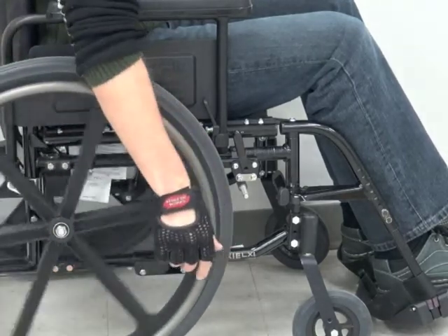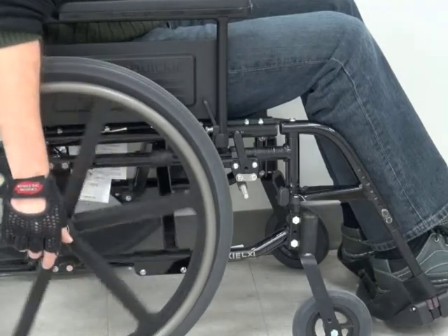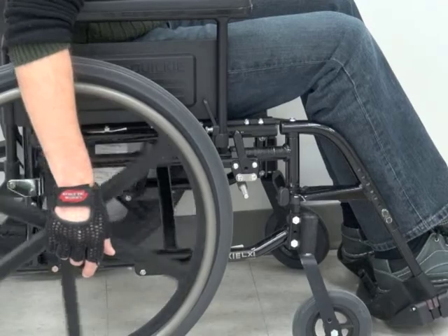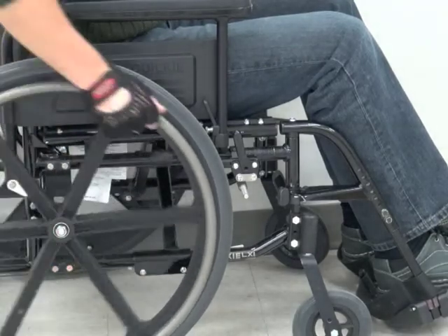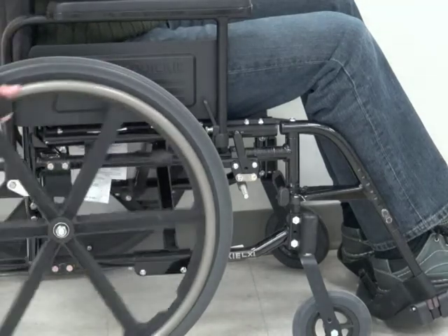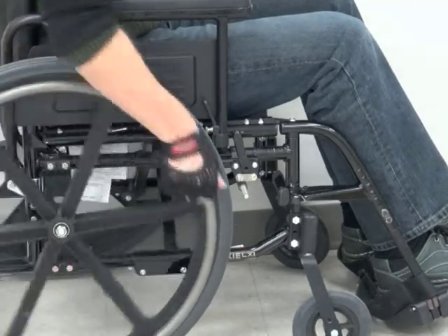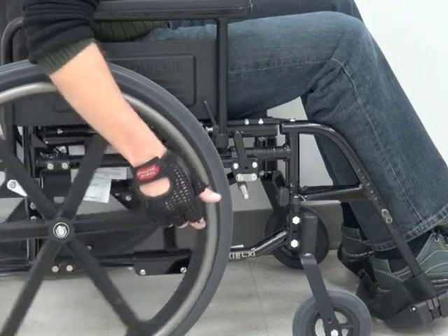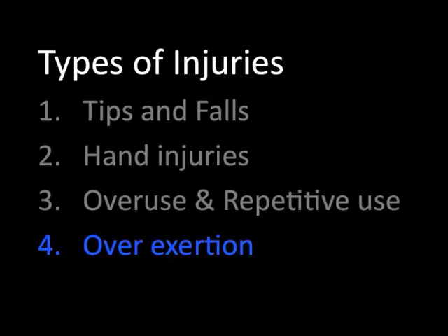First, try to take rest breaks so you are not propelling your wheelchair for very long periods of time. Second, try to use smooth, long pushes whenever you can and allow your wheelchair to coast before you push again. Finally, using gloves can help to soften the impact between your hand and the push rim, which can help to reduce injury. A fourth issue to be aware of is overexertion.